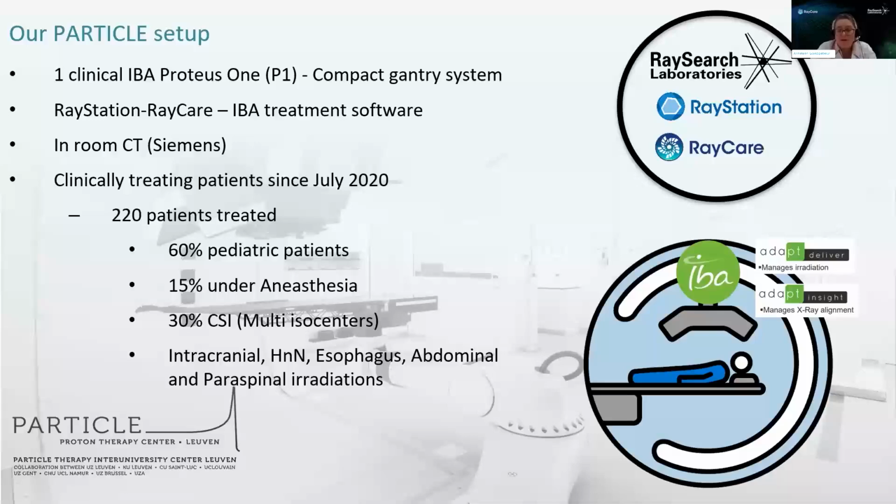Within our patient population, we treat really a majority of pediatric patients. So 60% of our 220 patients that we've already treated were less than 18 years old. And I would also say 15% of our patients are treated under anesthesia. So that's daily anesthesia, that is. And that's generally for children less than 6 years old.